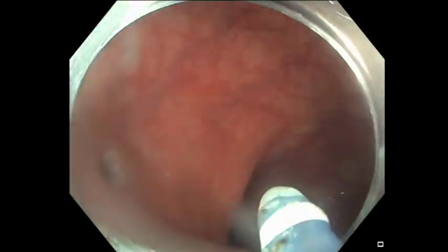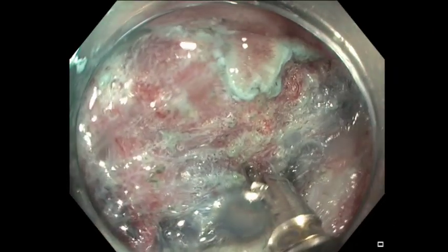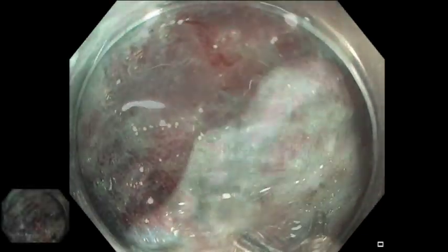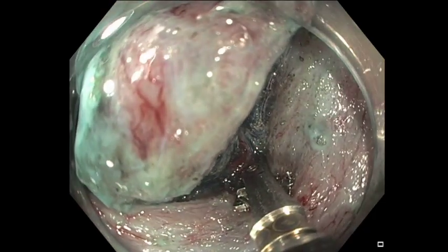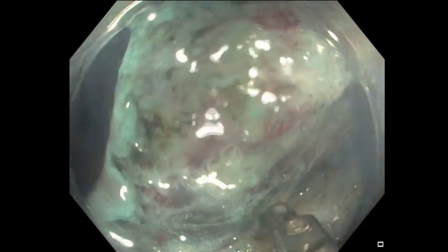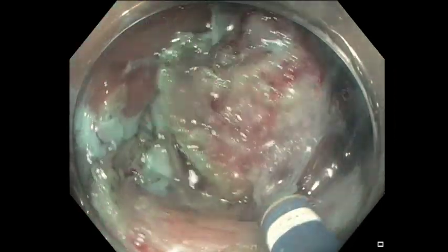So we're using gravity here to dissect from front to back and allow the lesion to retract to the back. And now we're also using a coagulation grasper to take care of the main feeder, the main blood supply of the lesion. This will allow us to have a cleaner dissection without bleeding after we expose most of the lesion. It's very important, when we dissect over a fold like that, to inject.